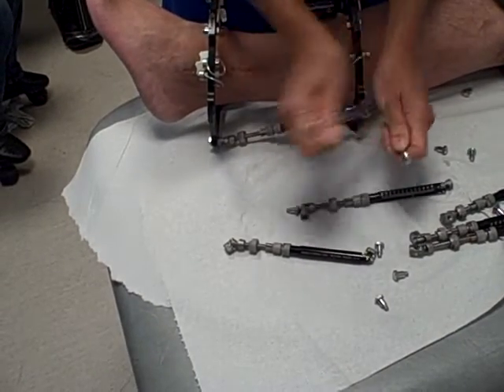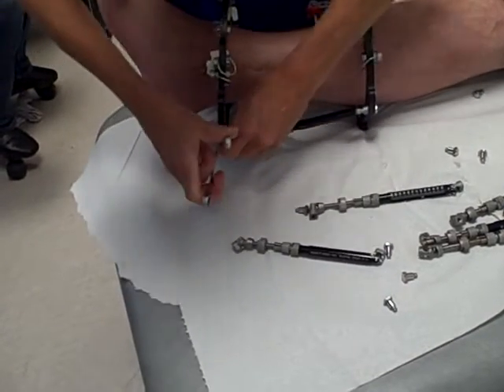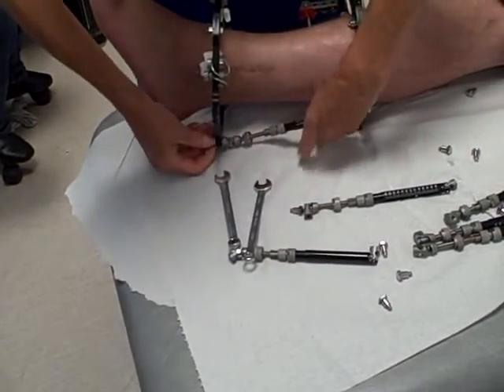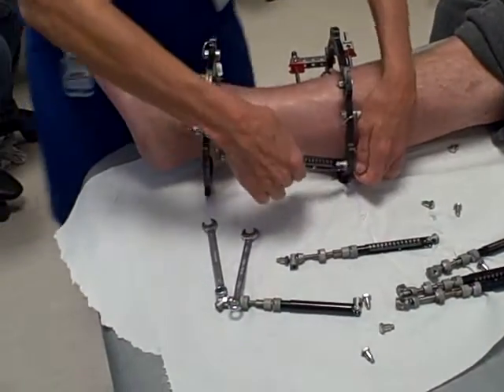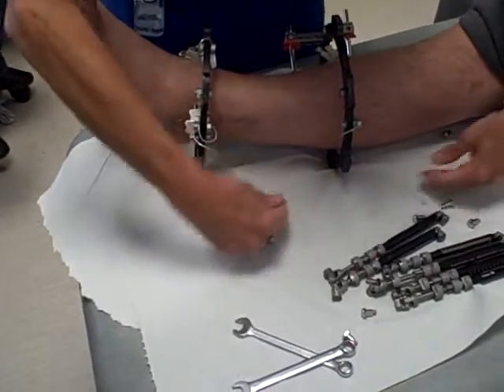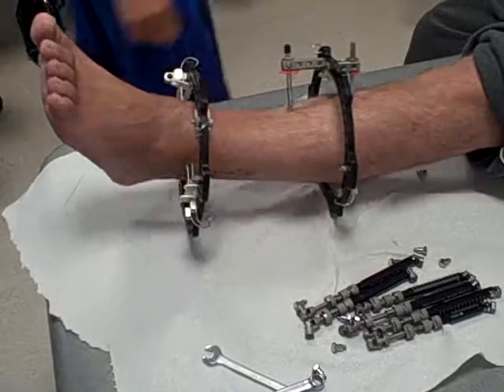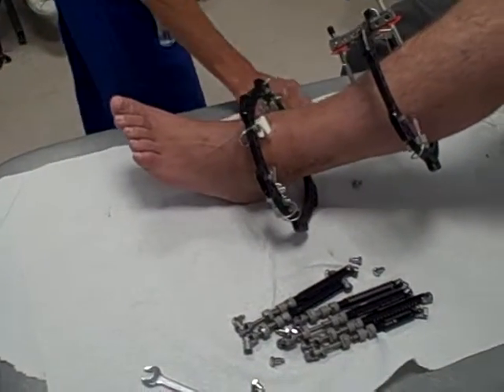Almost there. There we go — all of them. OK. Let's just see you walking up and down the corridor then. Just get off the bed and walk around the room a little bit. Do you want to pop your shoes on?